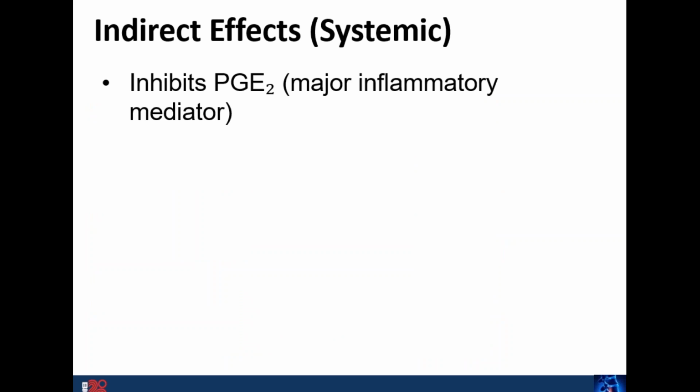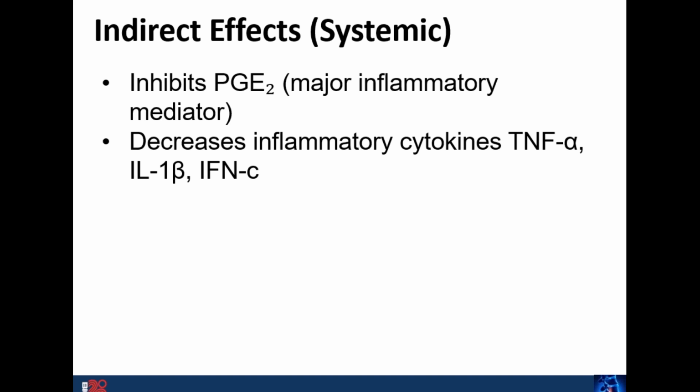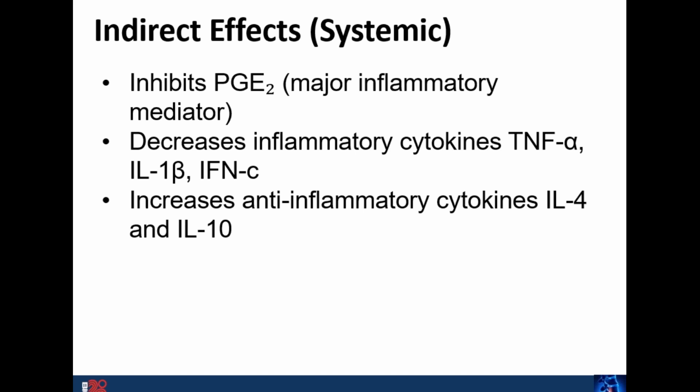So when we're treating a disc herniation, we're treating both directly with a laser probe, and we're treating all the blood and surrounding blood around the affected area. So what we're trying to do there is have an effect on the major inflammatory mediators like prostaglandins. Photobiomodulation inhibits PG. It also decreases inflammatory cytokines. That is, these are chemicals secreted by white blood cells that initiate and prolong inflammation. So light therapy or photobiomodulation is known to decrease these inflammatory cytokines, decreasing inflammation and helping with pain.